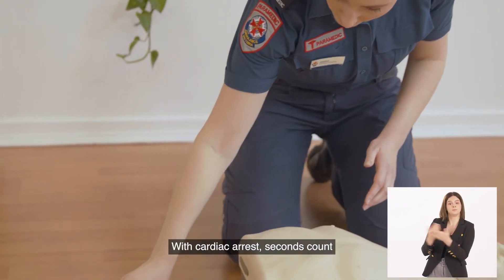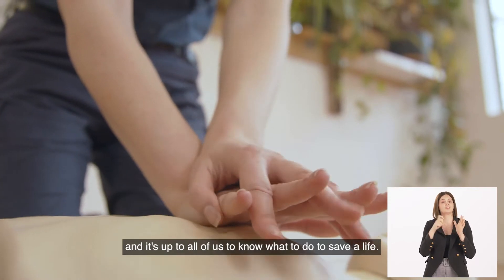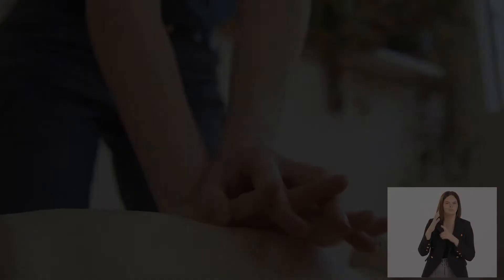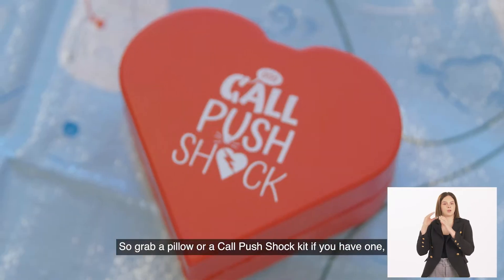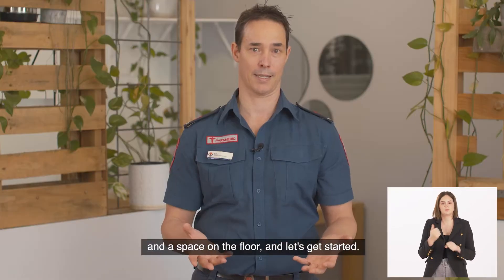With cardiac arrests, seconds count and it's up to all of us to know what to do to save a life. So grab a pillow, or a Call Push Shock kit if you have one, and a space on the floor, and let's get started.